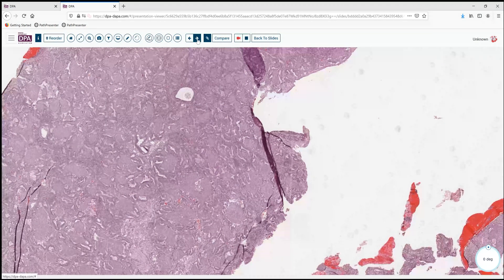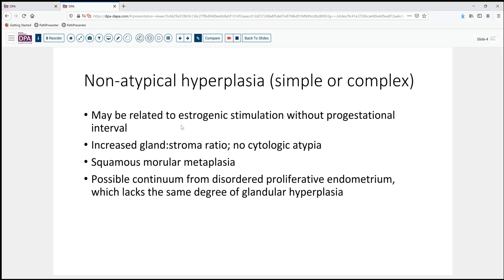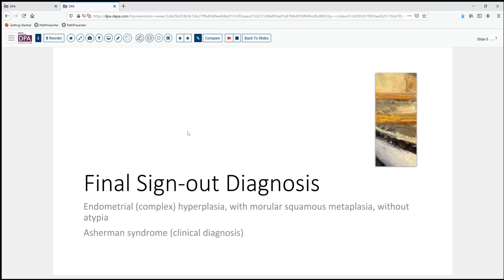To summarize: non-atypical hyperplasia does have an estrogenic stimulation component. There is increased glandular-stromal ratio but no cytologic atypia. Squamous morular metaplasia can be seen, and there is certainly some possibility that this is part of a continuum from disordered proliferative endometrium. Our final sign-out diagnosis is endometrial hyperplasia, complex, with squamous morular metaplasia, but without atypia. The clinical diagnosis of Asherman's syndrome we would not comment on pathologically, but certainly nothing disputes that assertion.